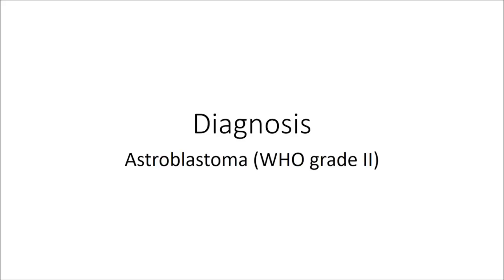low proliferation. This has always been a controversial entity, but it's still recognized by the WHO. It's important to be very critical when you make this diagnosis because you want to separate these. This is a pattern, really, that you can see in many different tumor types. You want to make sure, first, that it's not an ependymoma, and second, that it's not an infiltrating astro with an astroblastoma-like pattern, basically having clinging around vessels, but really having a more conventional infiltrating tumor.